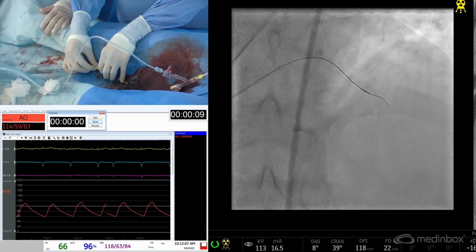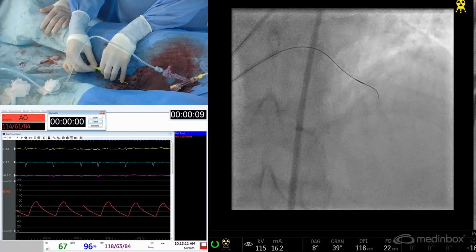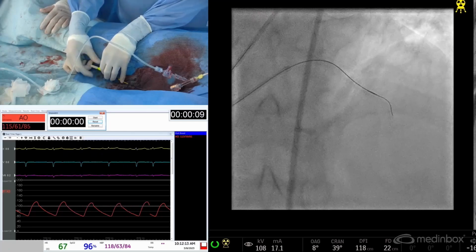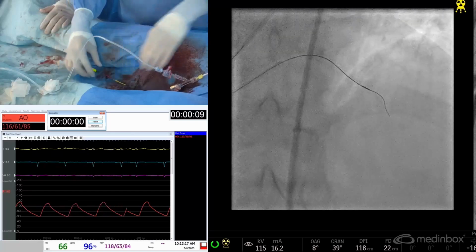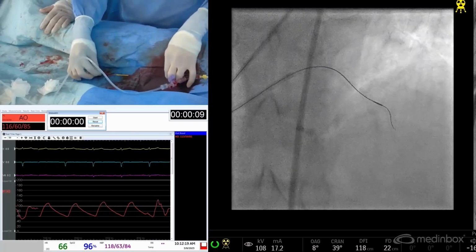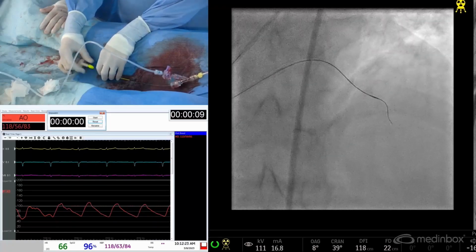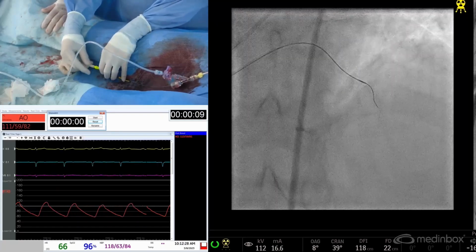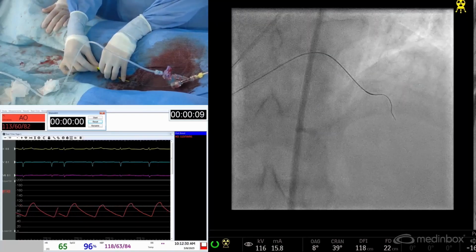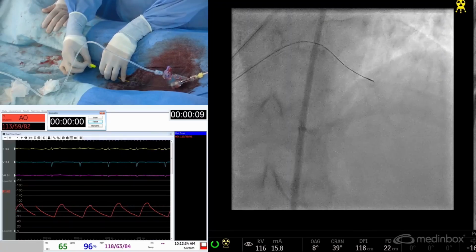When we previously did the angiogram, that's where we wrote in the slides that orbital atherectomy would have been a nicer strategy. We didn't anticipate the tightness of the lesion that we would have in the diagonal, especially in its proximal segment, when the initial team had managed to get their way all the way through to the mid segment of the diagonal.